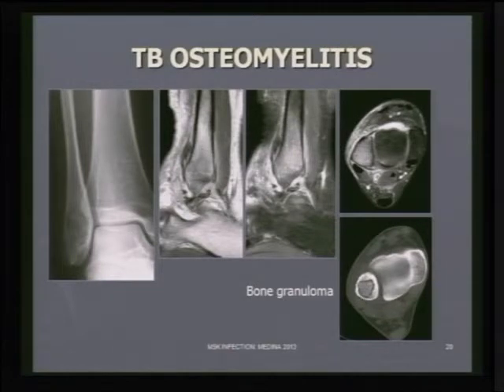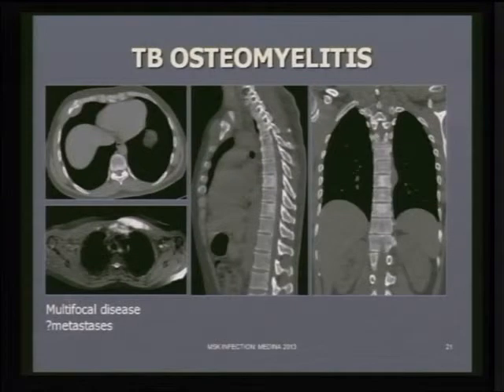This was biopsy-proven tuberculosis. The second point I want to make about TB is the relative frequency with which it presents as multifocal disease, and I'm going to show you a couple of cases. This is a young lady presenting to the sarcoma service with two masses on her chest wall. Here we have one seen on the CT study on the right side of the inferior chest wall related to the rib, and the second on the left side of the upper chest wall related to the sternum, with extension into the pectoralis major muscle here.